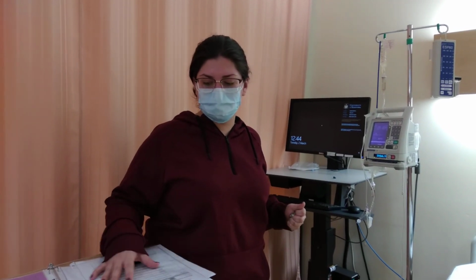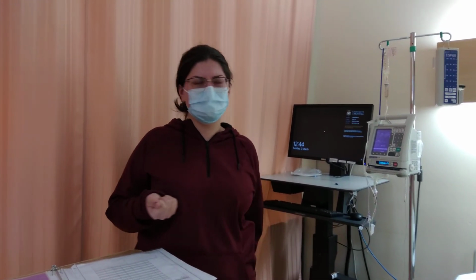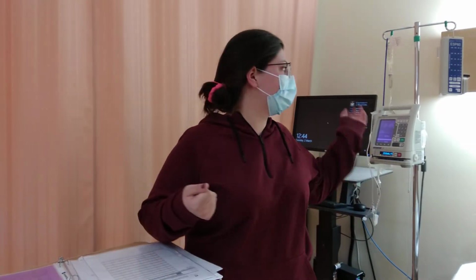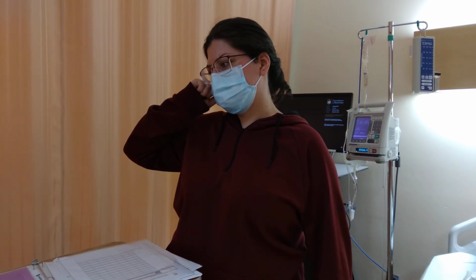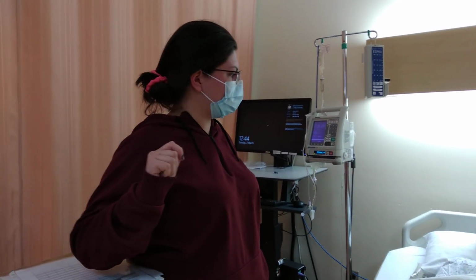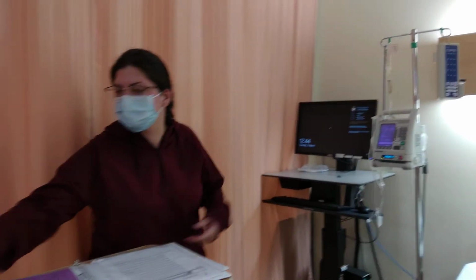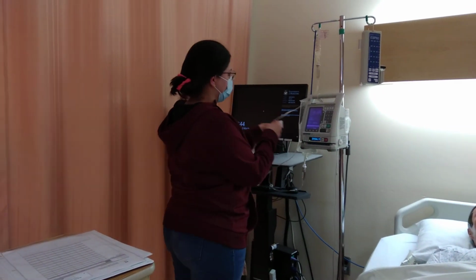I'm going to maybe document the fluid status sheet, or whatever it's called, just to say that we've given him this fluid. The side effects with this medication include electrolyte imbalance. So I let him know in case of any side effects. Right, so the tubing, at this point the patient has the right secondary tubing, the right medication.